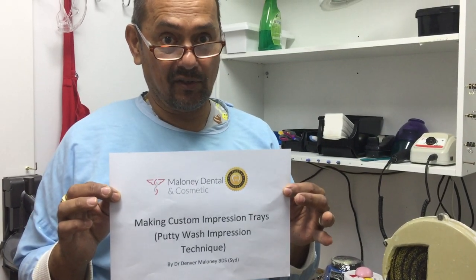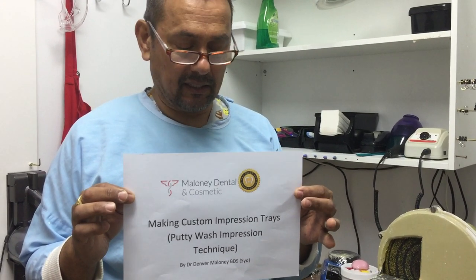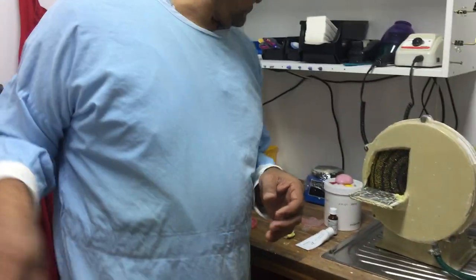This is a staff instructional video, though anyone can watch it. I'm going to be making a custom tray to do a putty wash impression technique.